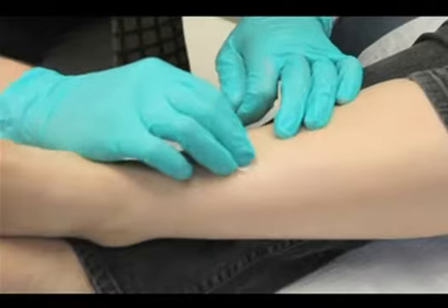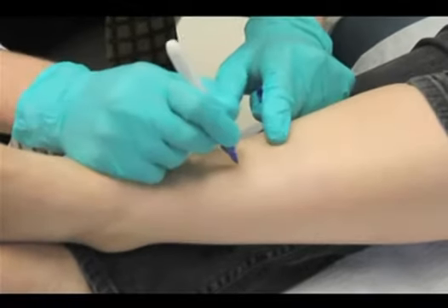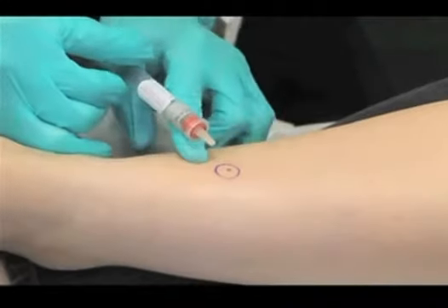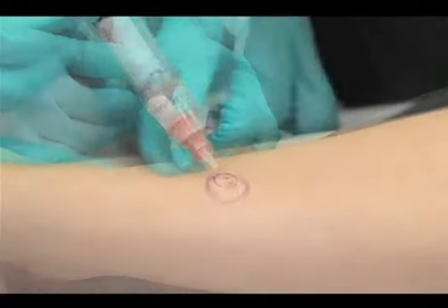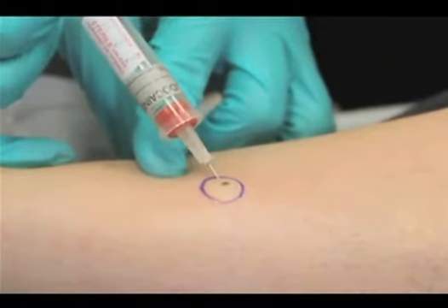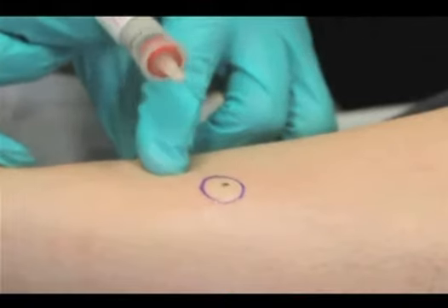Begin the procedure by cleaning the area with an alcohol swab. If the lesion is poorly demarcated, it can be outlined with a skin marking pen before the procedure. Anesthetize the area by inserting the needle parallel to the lesion and slowly raising an intradermal bleb under it. If necessary, while the needle is still in the skin, partially withdraw it and reset the angle of the tip to anesthetize the area more widely and deeply.